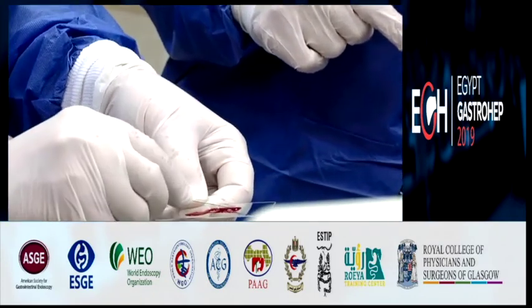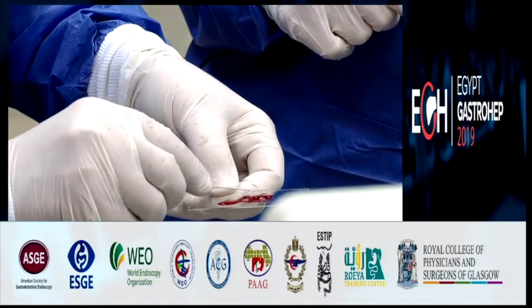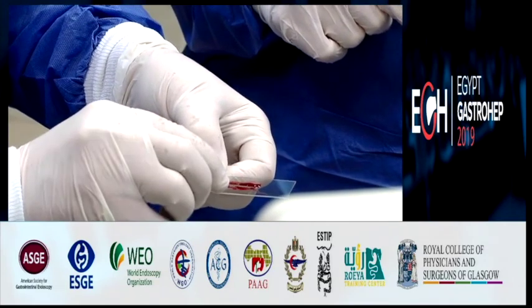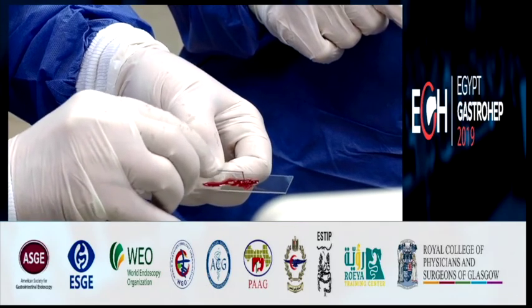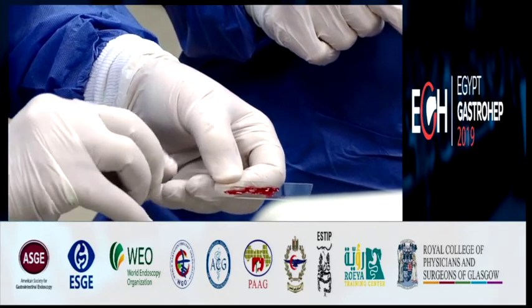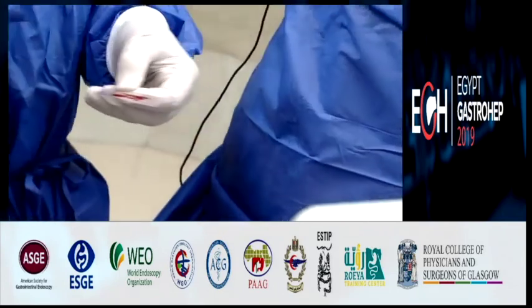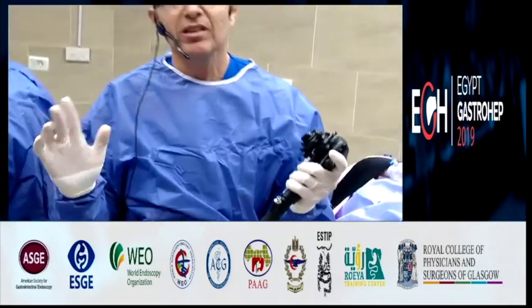But that's nice. You see, this is pancreatic tissue, because it's completely white. It's not clot. This is clot, but this is pancreatic tissue. So maybe we should put this in formaldehyde. Yes, this is very important. This is the white tissue.